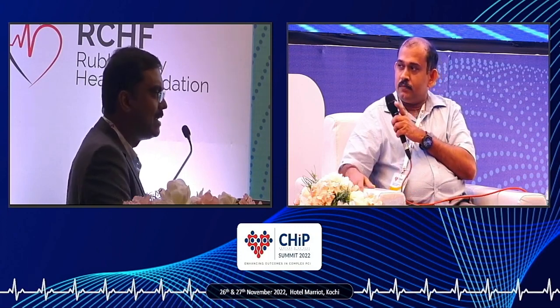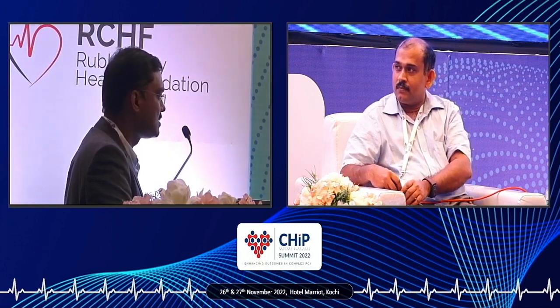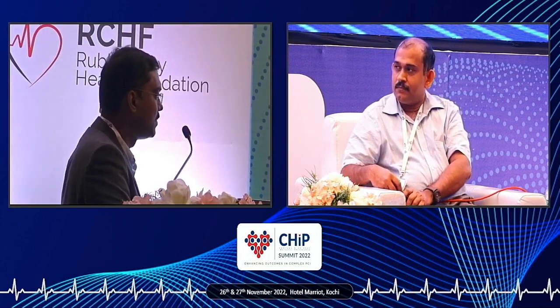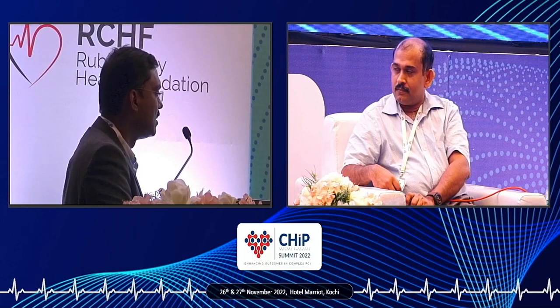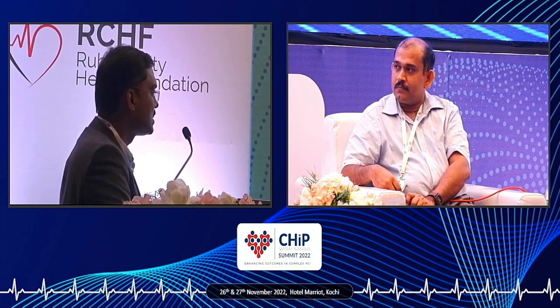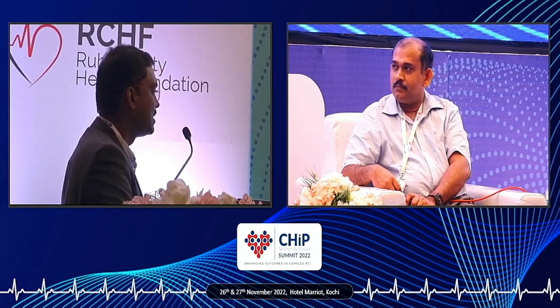Yes. For any restenosis, two things are mandatory for me. One is stent boost, stent enhancer, which will give you evidence of a stent gap or stent fracture, even though imaging can do it. The second thing is to understand the mechanism. Though angiographically it may look properly expanded, with imaging it may be underexpanded. Without imaging, I will never do an ISR, because it's the second time; we are doing a second procedure on the patient. I am talking about typical ISR. After doing imaging, you will understand what you need to do.